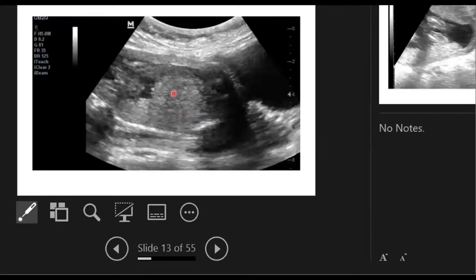This one is when you see, because we have a full bladder here, we cannot really see the cervix properly. And this placenta is looking like it's completely covering the cervix. So we should not examine a mother with an over-distended bladder. We should see the cervix, the anterior myometrium and the posterior myometrium as well. Then we'll be able to say the placenta is in this position. We are just training our eyes on the different images that we can see.